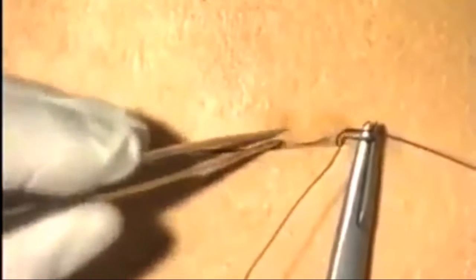Each new suture must be inserted almost opposite the exit of the previous suture and this ensures that as the suture material is tightened it draws the wound edges together almost in the manner of invisible mending. The accuracy of the placement of the sutures will ensure an equal tension down the wound and neatness of the closure.